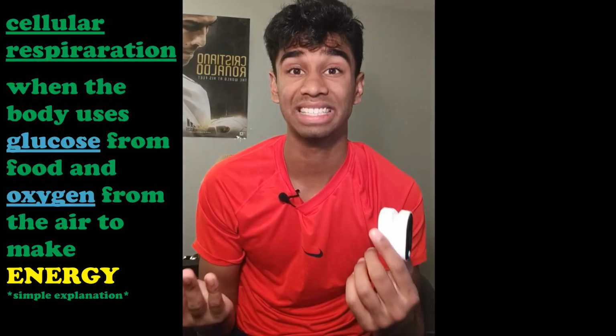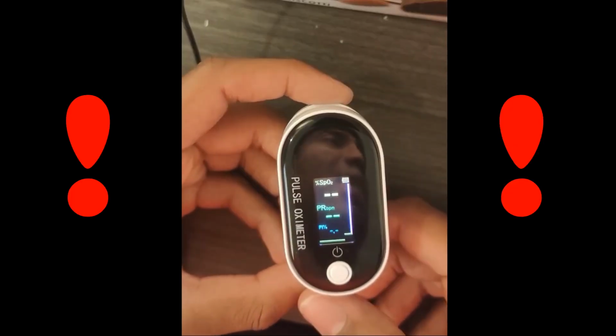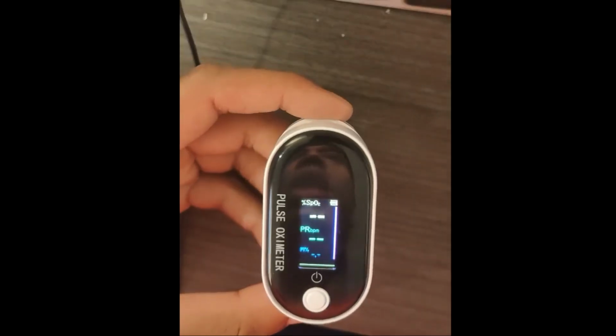and respirate cellularly. Right then, let's see what this device looks like when you put it on and measure for oxygen saturation. Right, let's turn this thing on. Press the on button. What is this? Wow, this looks a bit crazy. Let's take a look at it up close.